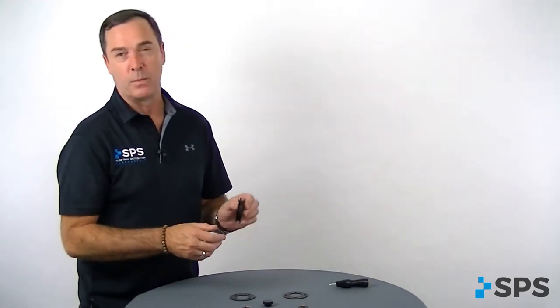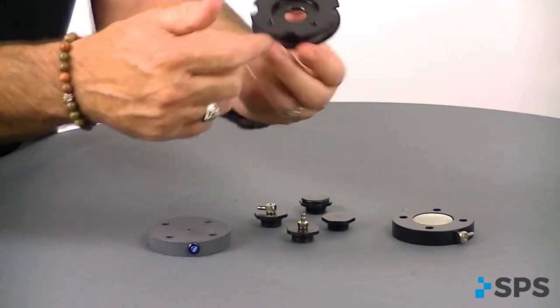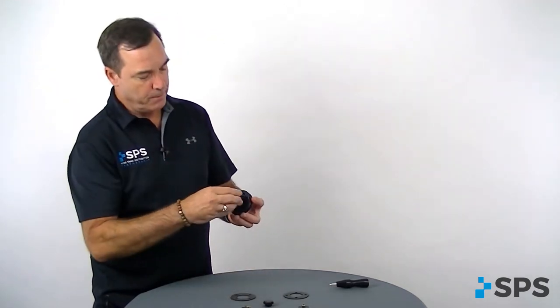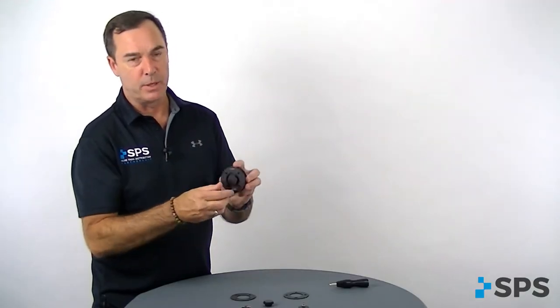Cypress tie-in plates are very similar to some other plates you've seen on the market. There are threads in the center and tie-in notches. Cypress also came out with different inserts to be used for different applications. One is just a plug, so if you just want to plug that off and use it as an attachment plate.